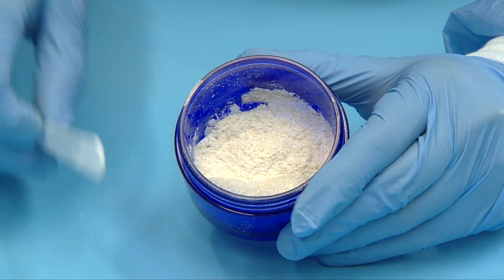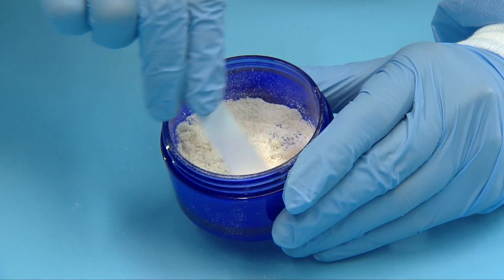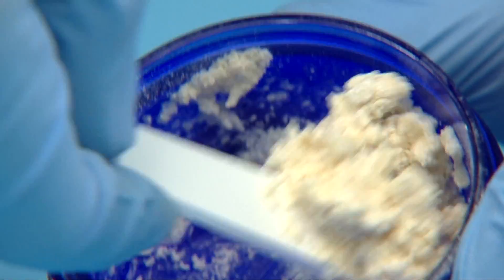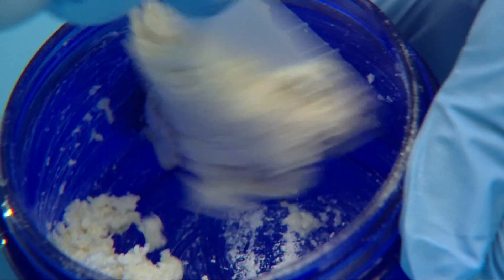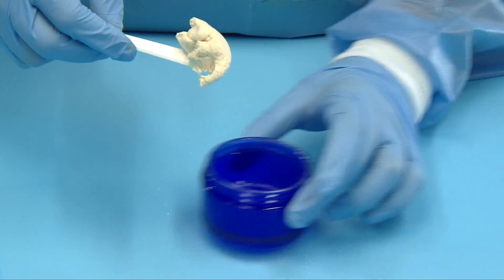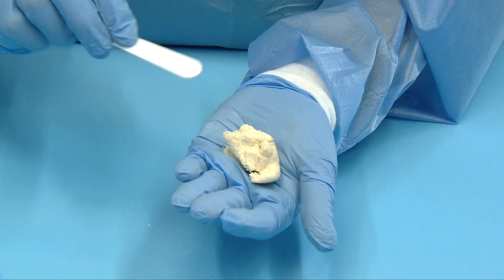With the broad end of the spatula, spread the material against the sides of the jar to facilitate mixing. Make sure to mix well and gather all powder and saline into final putty form.